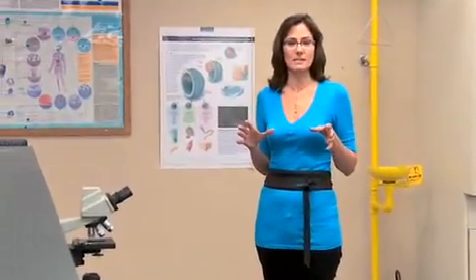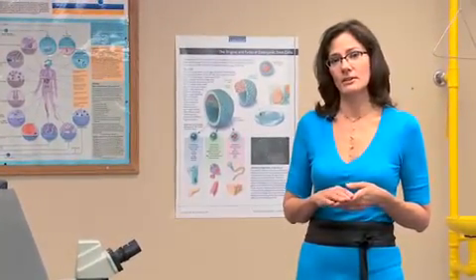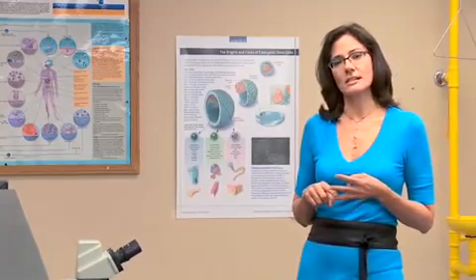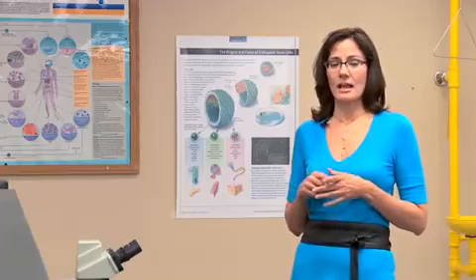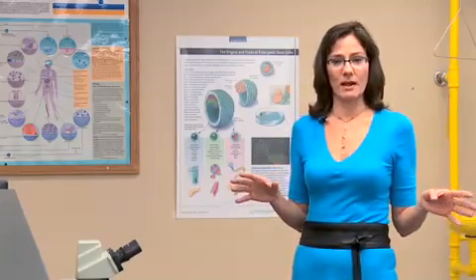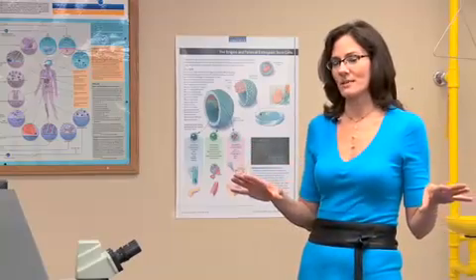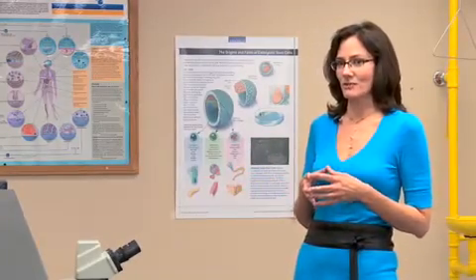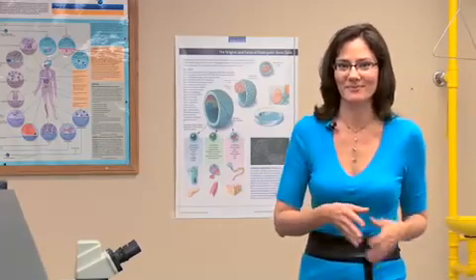To fully appreciate all that tissue engineering encompasses, ideally one understands many different concepts, including those of embryogenesis, angiogenesis, adult and stem cell biology, material science, histology, and the cell culture techniques that we run in this course. While we teach a lot of wonderful experiments in this outer lab area, in my personal opinion, I think we have the most fun back in the cell culture room. Why don't you join me there now?